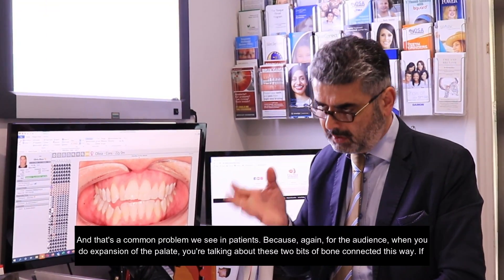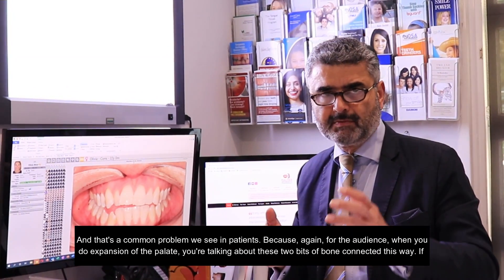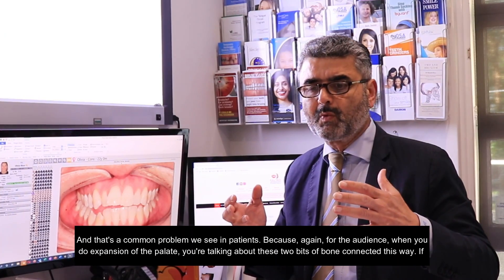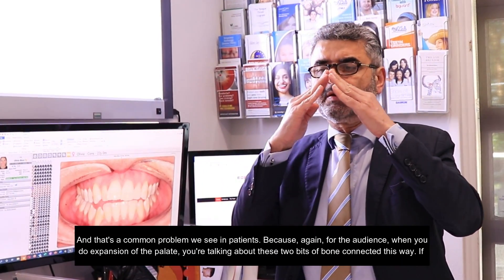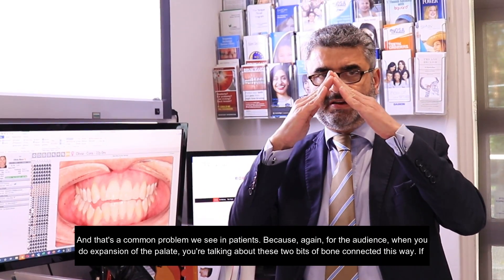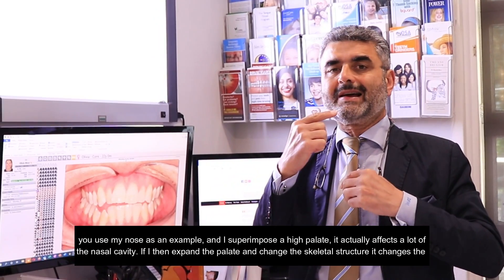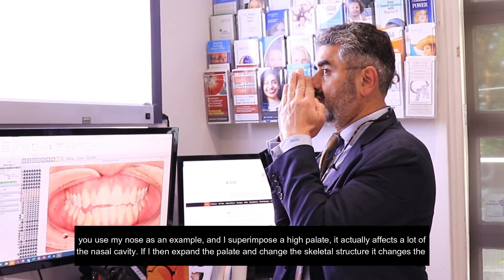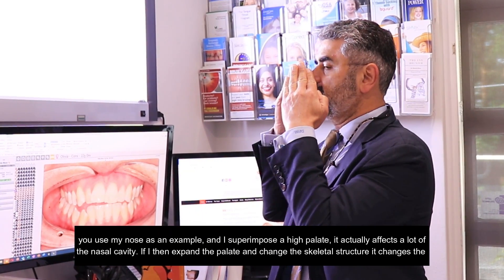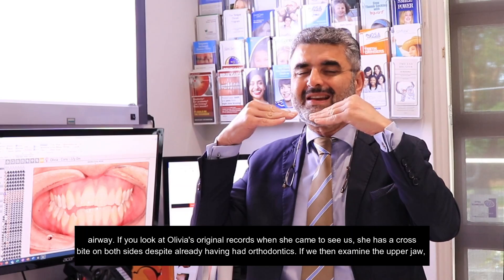For the audience: when you do expansion of the palate, you're talking about these two bits of bone connected this way. If you use my nose as an example and I superimpose a high palate, it actually affects a lot of the nasal cavity. If I then expand the palate and change the skeletal structure, it changes the nasal airway.